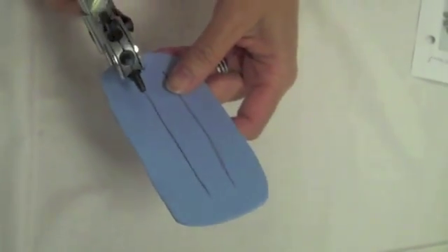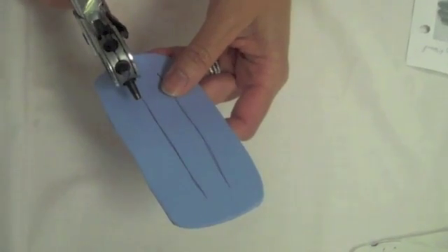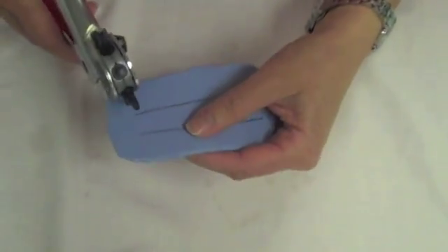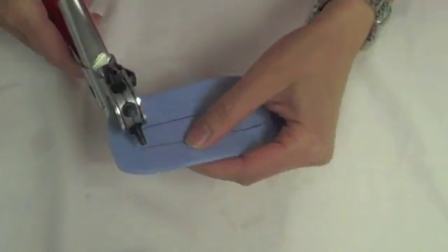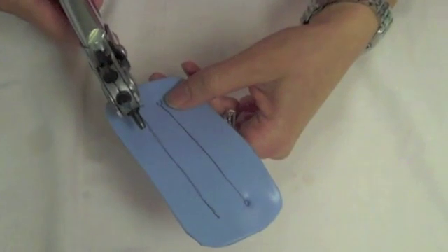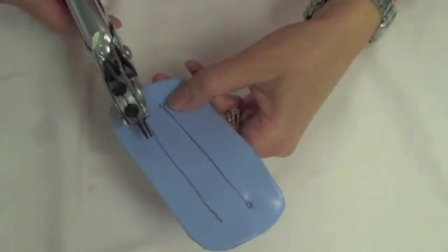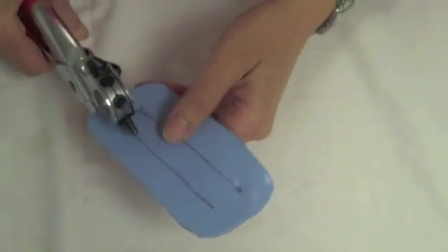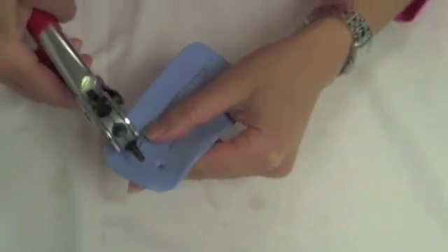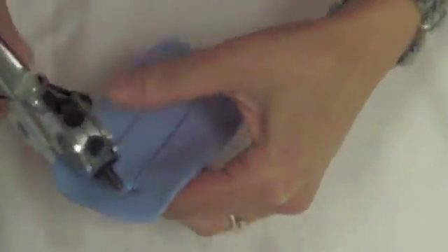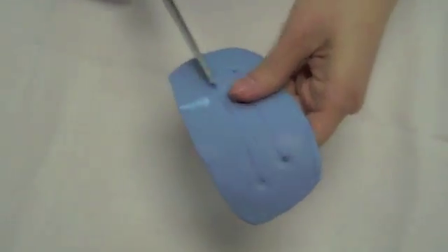Take the hole puncher and punch a hole at the ends of each of the lines. Cut along both lines to create the bar segment of the lumbrical bar splint.